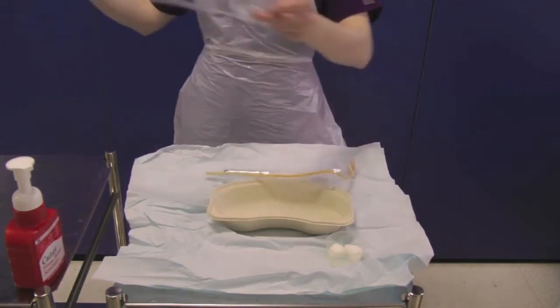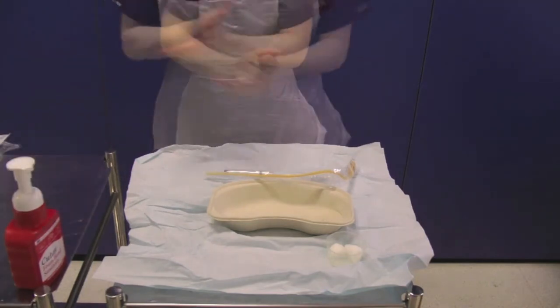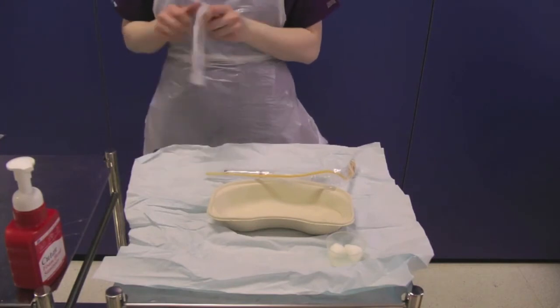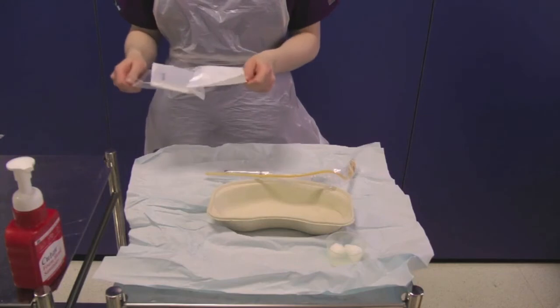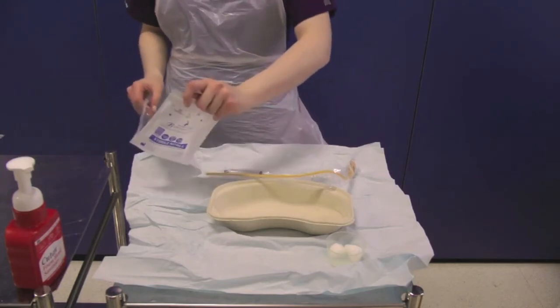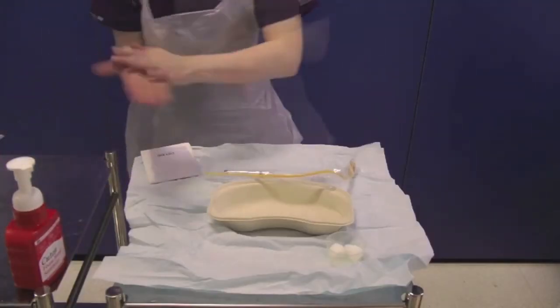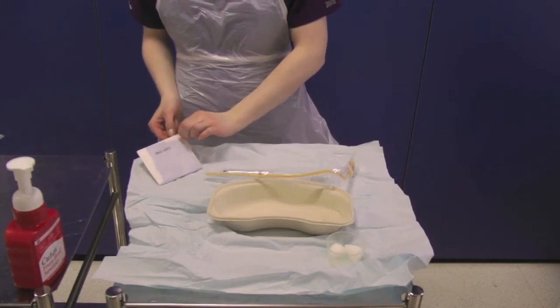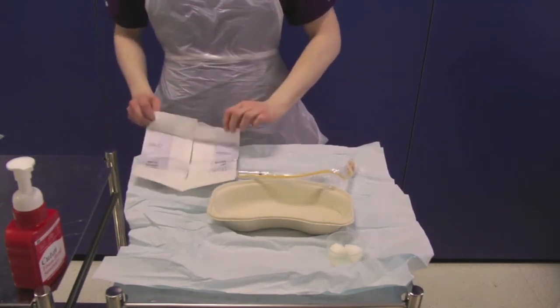Open the outer packaging and carefully drop the catheter and syringe onto the sterile field. Be very careful not to touch the sterile field with the non-sterile outer catheter packaging. Open the outer packaging of a pair of sterile gloves and drop the internal packet onto the sterile field. You must now decontaminate your hands. Carefully open the sterile wrapping, ensuring you do not touch the sterile field, and put the gloves on.